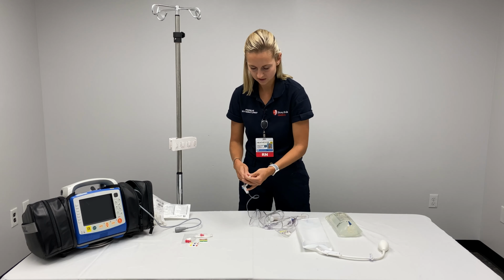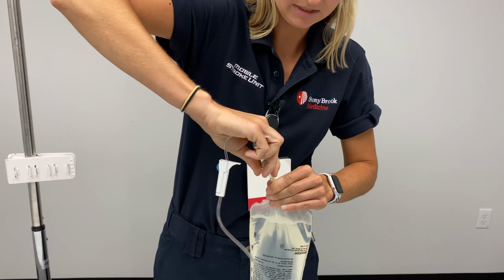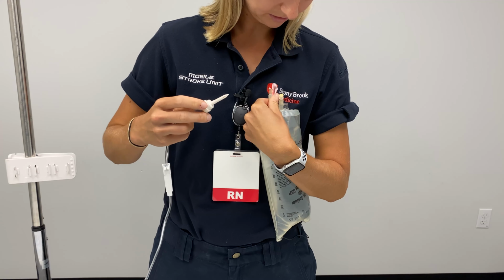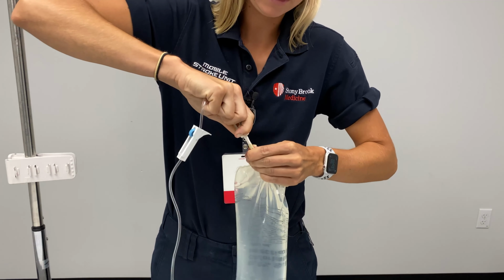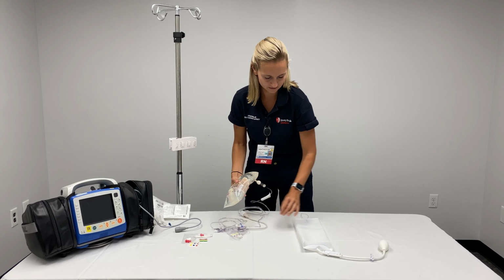And the first thing that I do is you're going to want to remove the air from your bag. You're going to spike your bag, then you're going to unspike it. And I kind of put it under my arm. Slowly push out all of the air until you get a tiny bit, and then respike it. And now your bag is free of air.